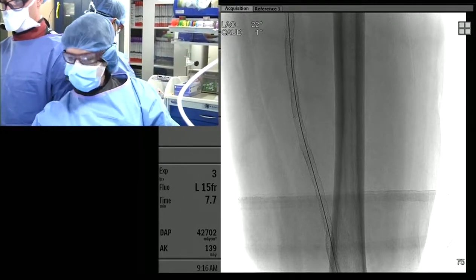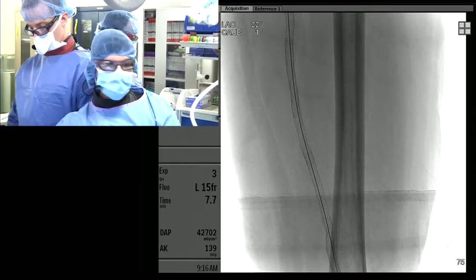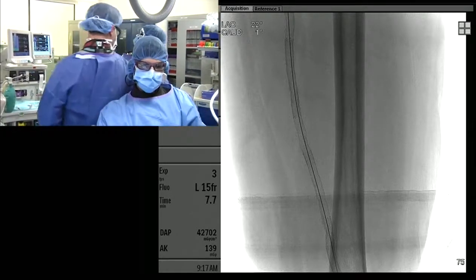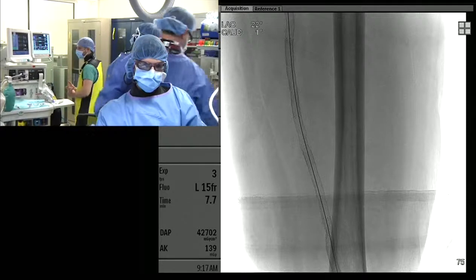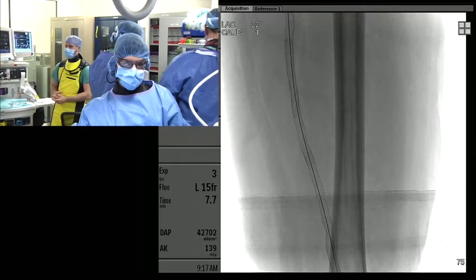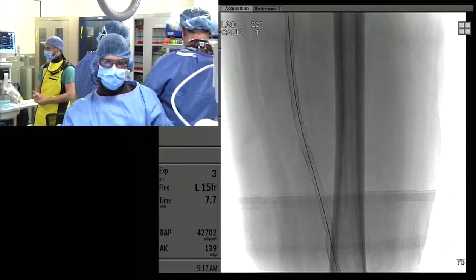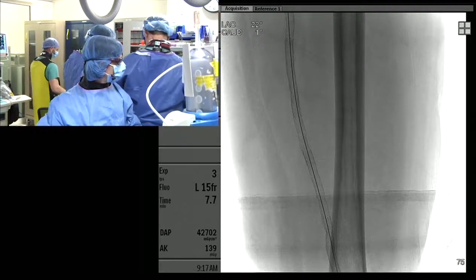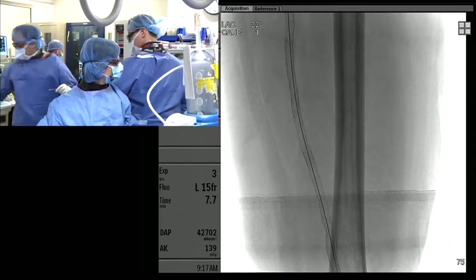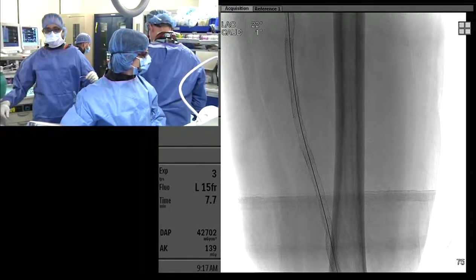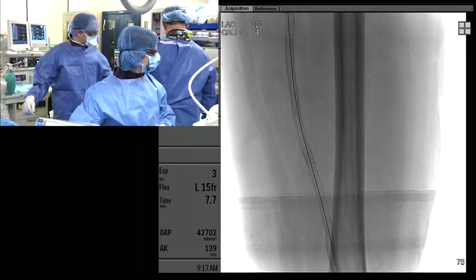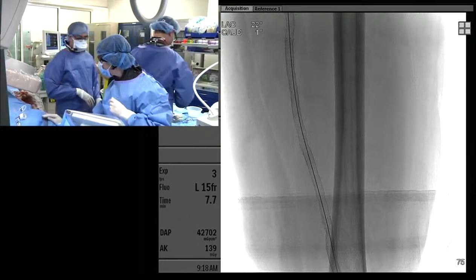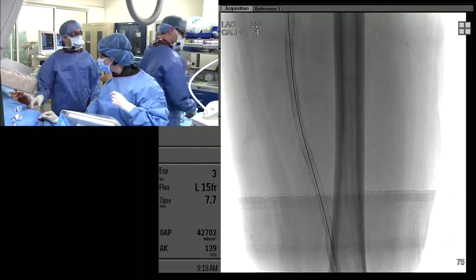The guide wire is an exchange-length Amplatz, 280 or 260 centimeters, and we're running into an issue — it's actually not long enough to do the exchange because the balloon is 135 centimeters. We have the wire down pretty far. We have a Medtronic Metacross, which is rapid exchange, but we're not sure if it will fit through the guide catheter. To avoid these exchanges, we're going to switch out to a longer 0.018 wire.